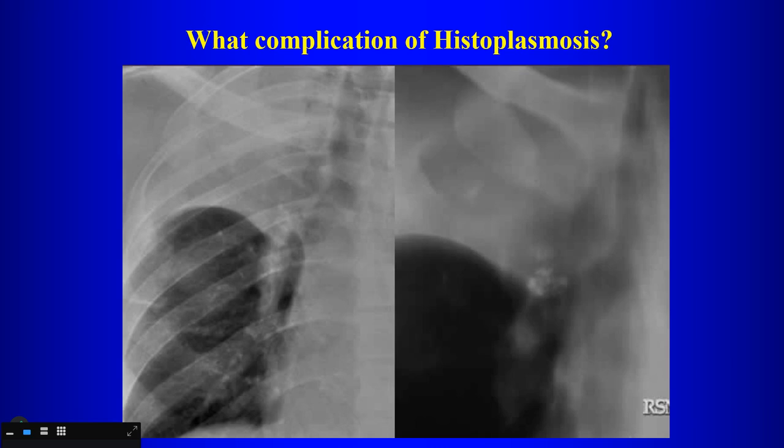No, like the overexposed. That's a tomogram. You guys heard of tomograms? Yeah, breast. Yeah, you used to be able to do the same thing with chest radiographs and also abdominal radiographs, is that you were able to basically focus in on a particular plane and blur out everything anterior and posterior to that plane. So, of course, not necessary anymore. But the finding on the chest radiograph is what?